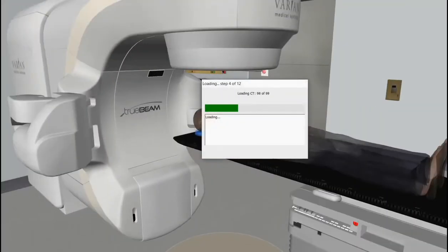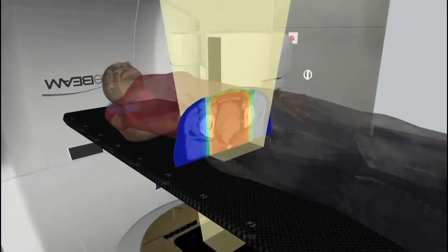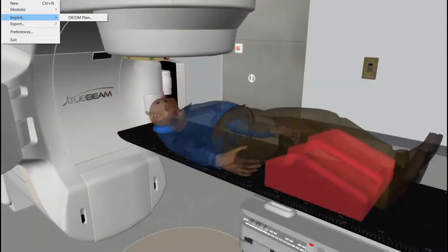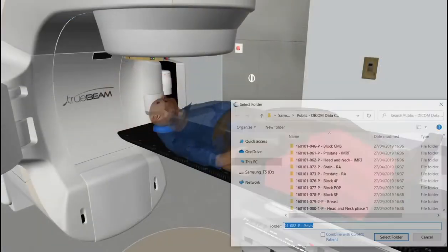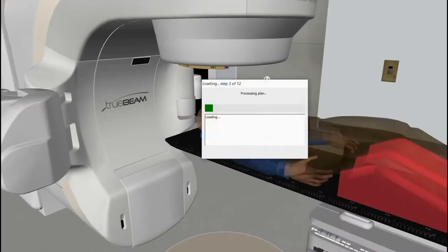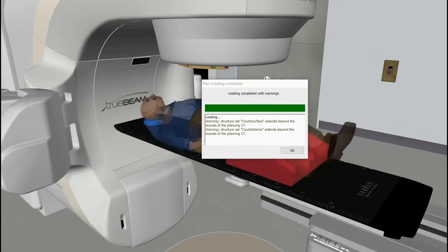VIRT supplies a range of DICOM data containing treatment plans of an assortment of body sites and techniques. These can be used by teaching departments to talk through the evolution of radiation therapy, as well as introducing the most up-to-date techniques.